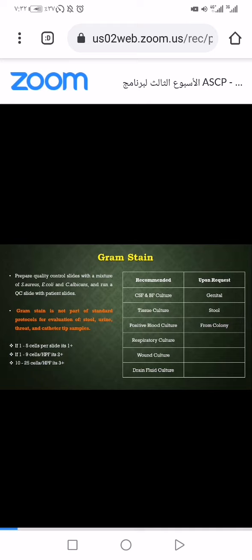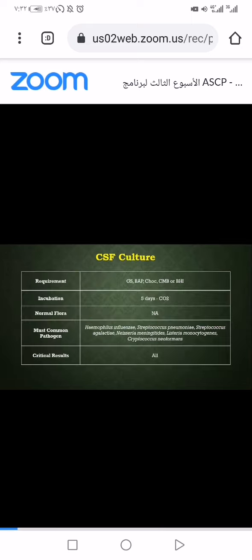Sometimes it's more than 25, we call it 4 plus also. Okay. Next. So first type of culture, the CSF culture.